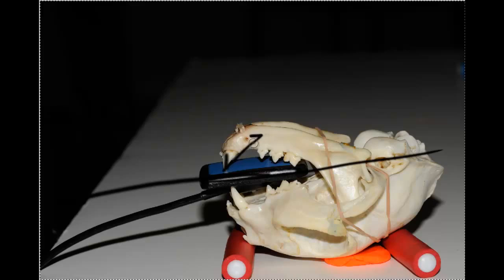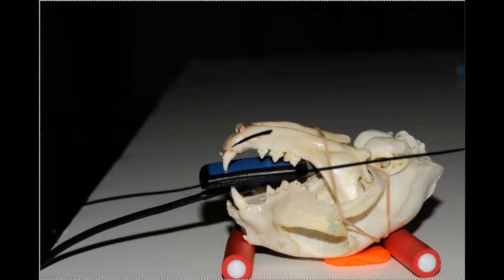And this tooth is actually close to vertical here and close to horizontal there. The overall angle is a straight line from the apex to the crown. But I like to think of the angle of this or these teeth as being roughly like so. So, we have the sensor like so and the teeth like that. So, we have a very acute angle here. Not a whole lot of difference between them.